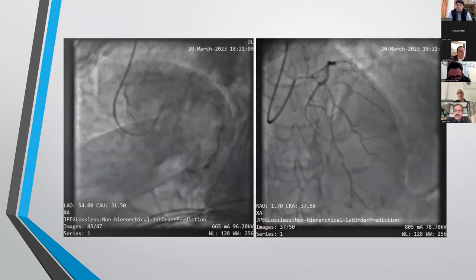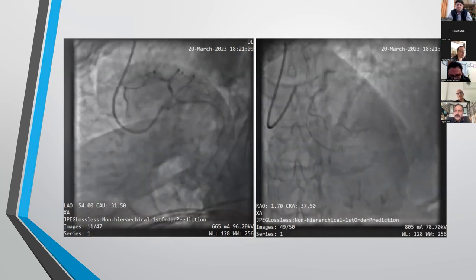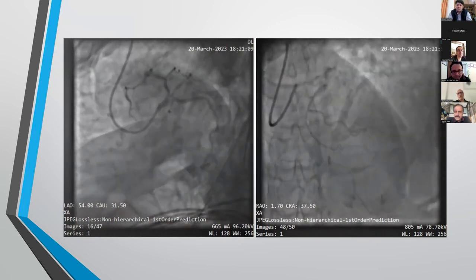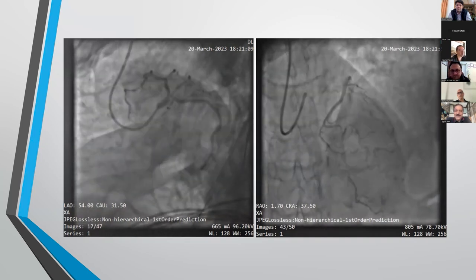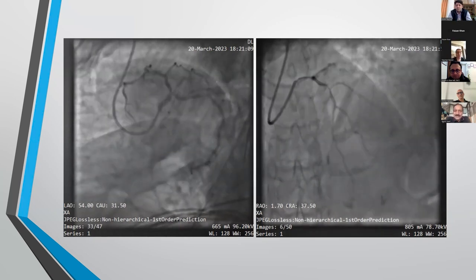Yes, you're absolutely right, for lab throughput it takes a little more time, but in 5 minutes it gets prepared and then we do it. So that would be my only point. And I think for left main, generally my go-to is IVUS, but in certain situations I would use FFR or IFR as well. It takes less than 5 minutes actually. For us, within a minute or two, they are already ready to do it, which I find potentially consistent.